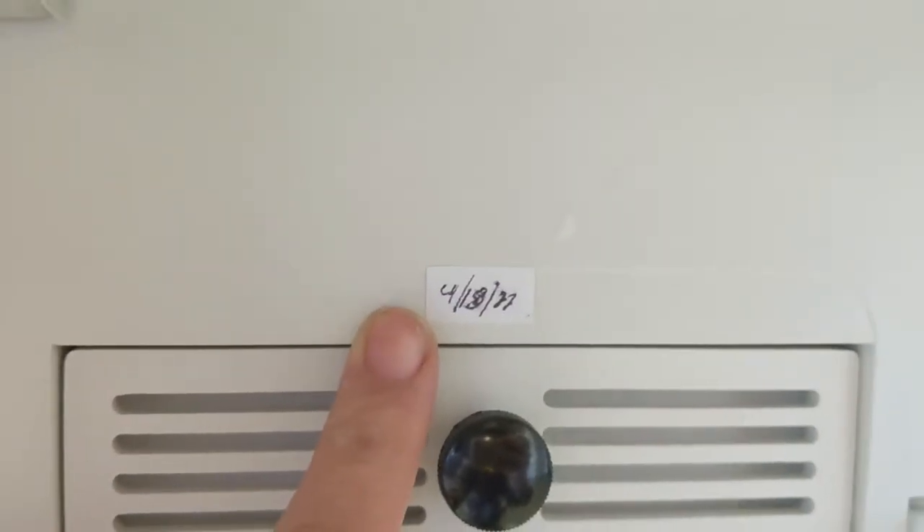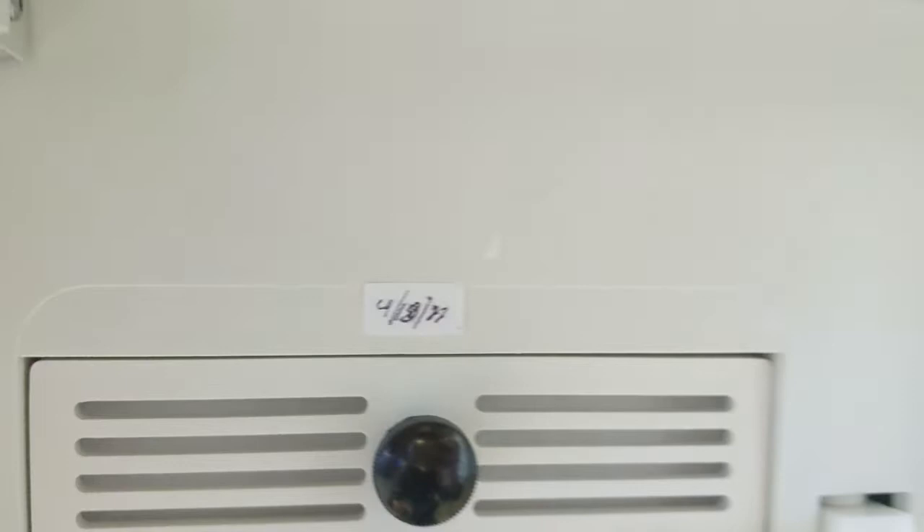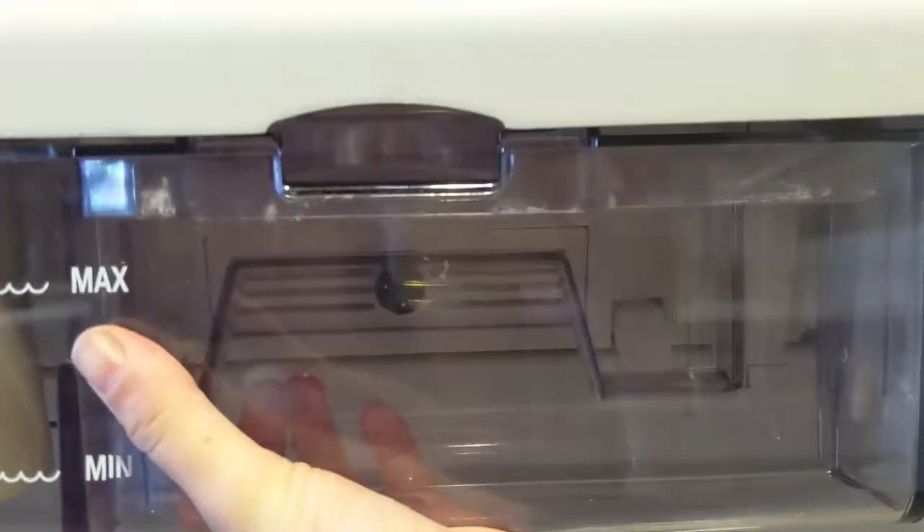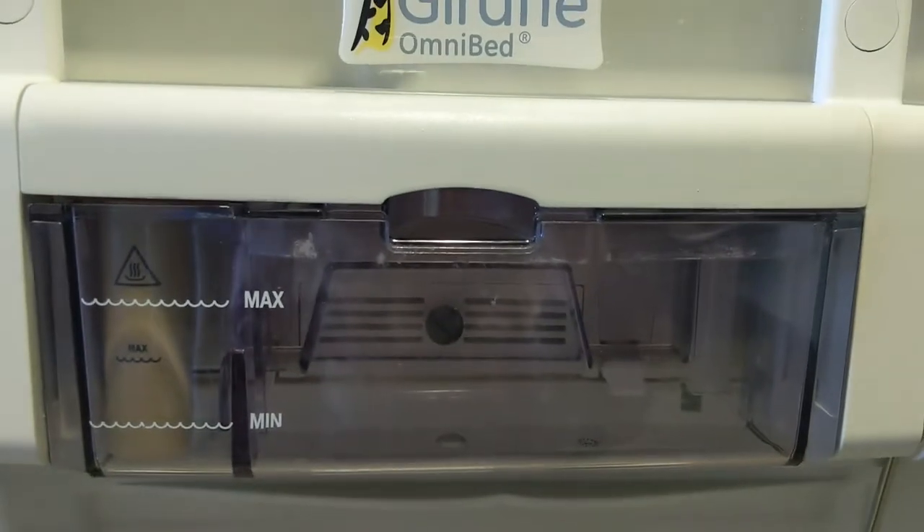Place the date on a sticker that comes with the filter on top of the filter there. Replace the humidity container. And that's it.